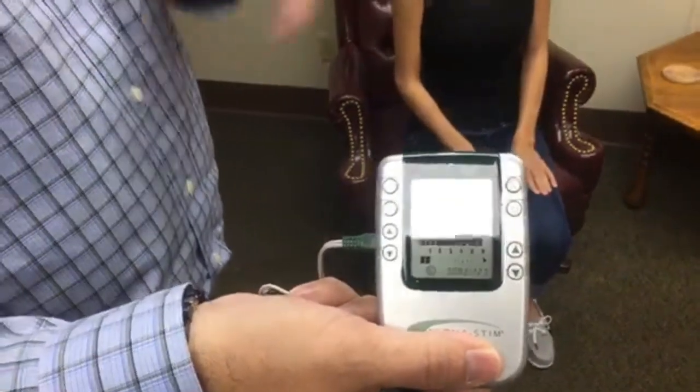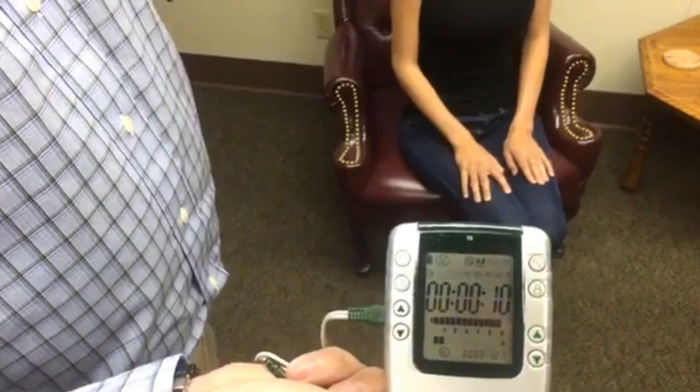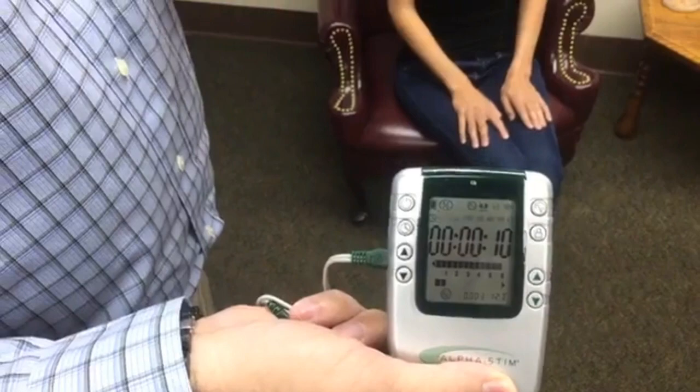In total, our protocols last from about 2 to 5 minutes, depending on the person's pain — where it's at, if we need to treat a little further. If they have some residual pain, there are some tricks we can do. But all in all, it's about 2 to 5 minutes.